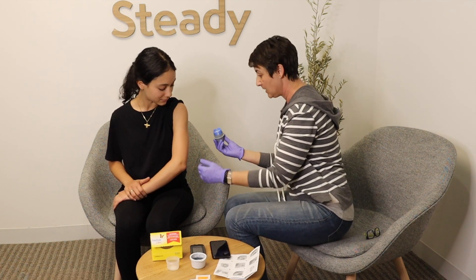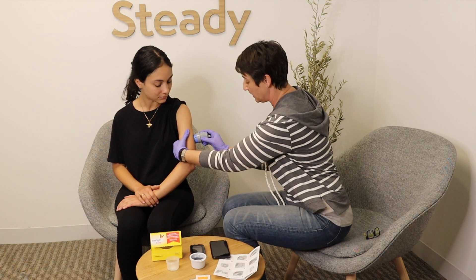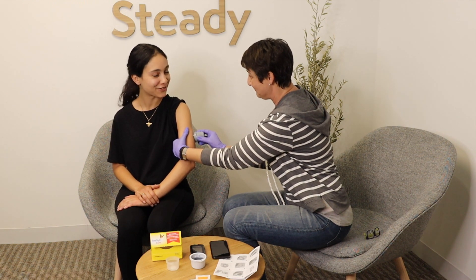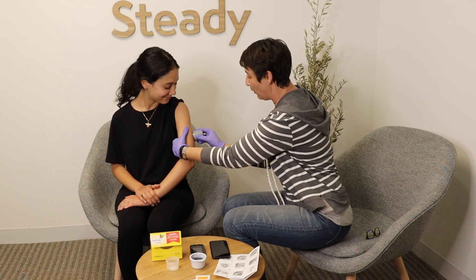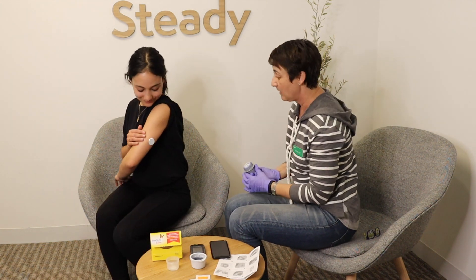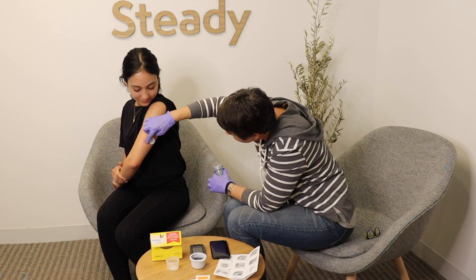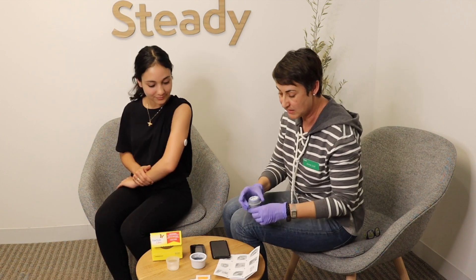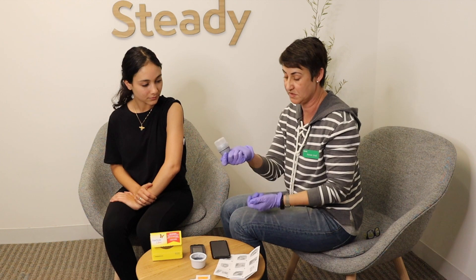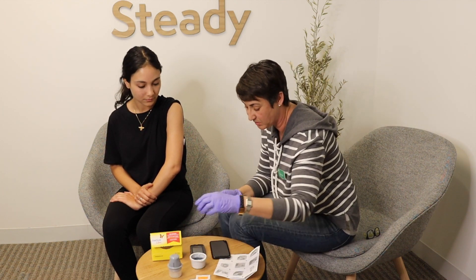On the count of three, you'll feel a little pressure on your arm — one, two, three. And there we go — didn't really hurt. Now we pull it straight back off and there's the sensor in place with a tiny little bit of tape to hold it in place. Always recap the applicator — even though there's no needle to be seen since it's a fully contained needle — just for safety and disposal purposes.